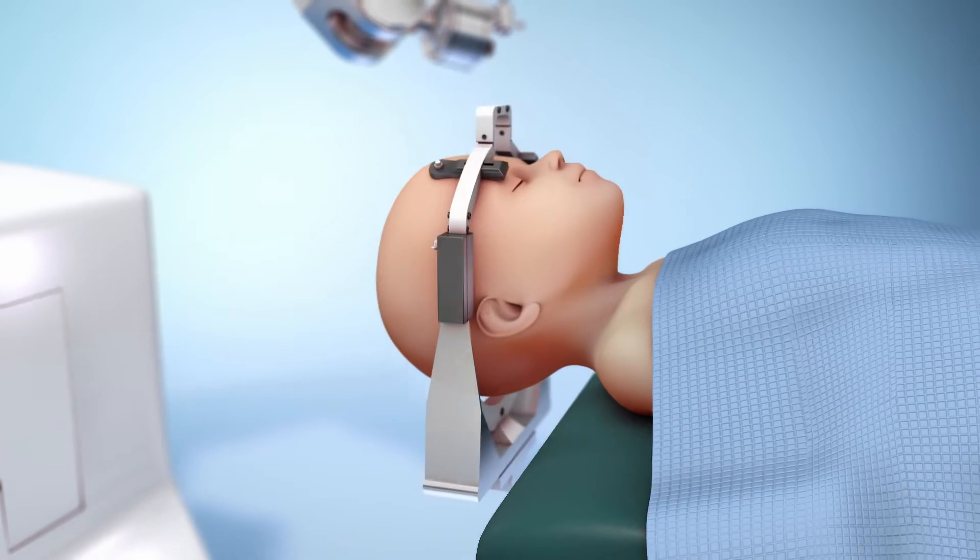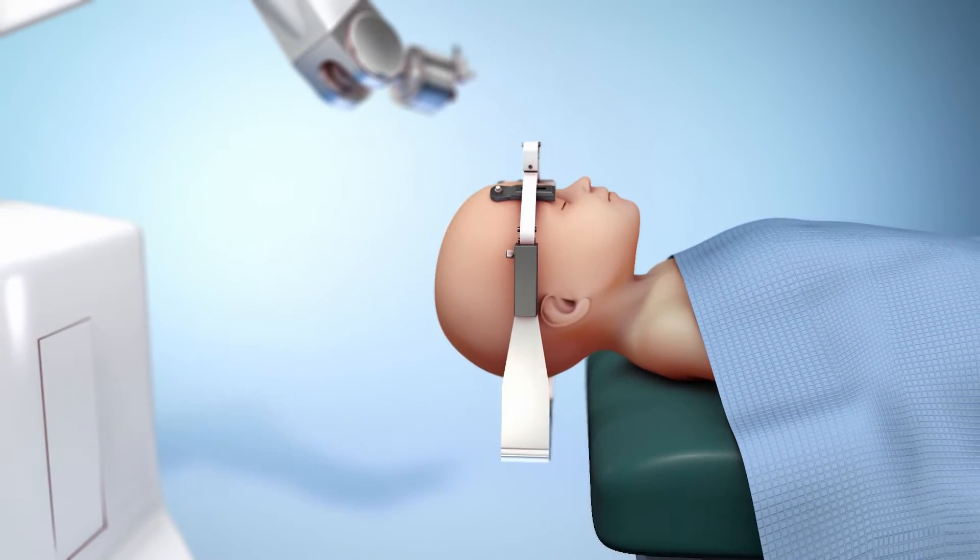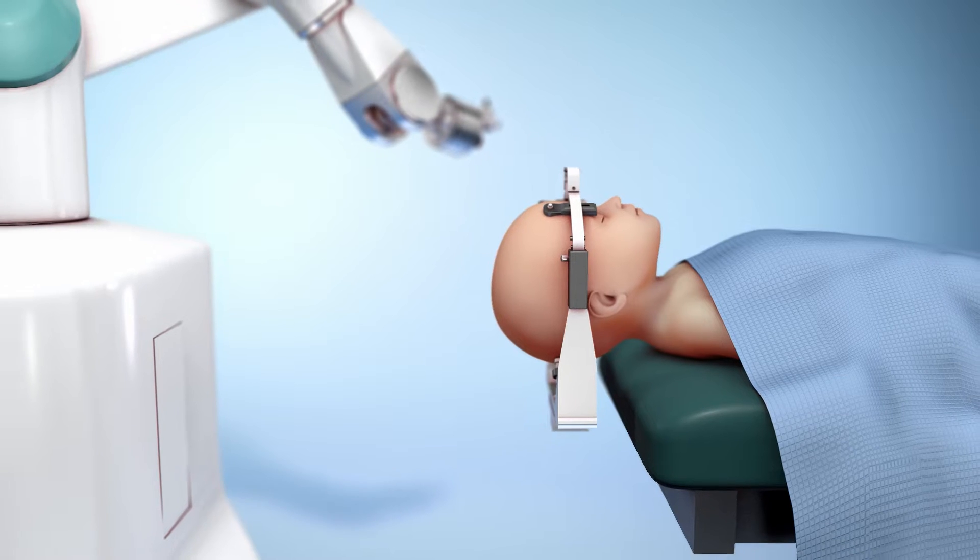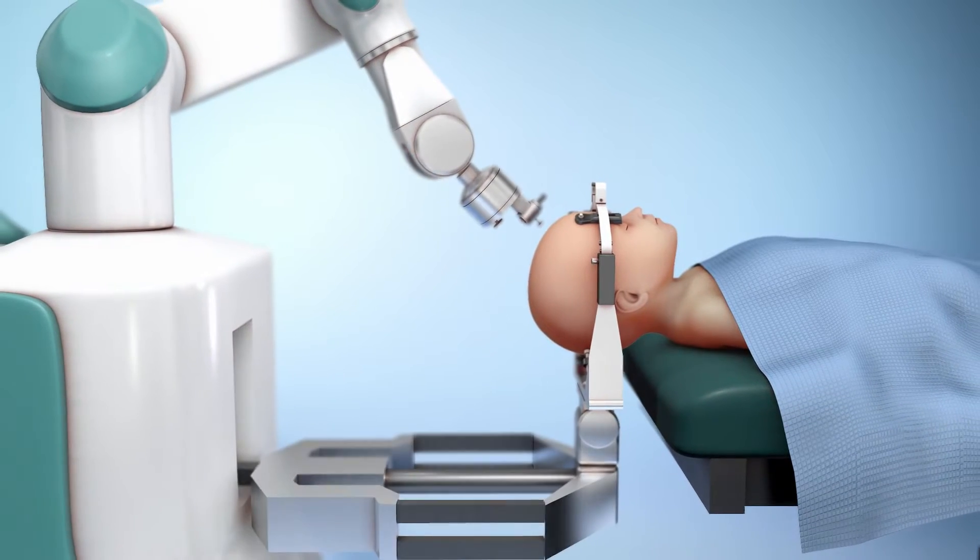A robot will be used to insert electrodes into the brain to help find where the seizures are happening. To begin, the surgeon will secure the patient to make sure everything is aligned with the robot. Then, the patient is connected to the robot.